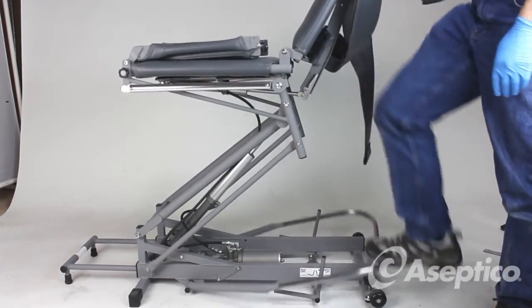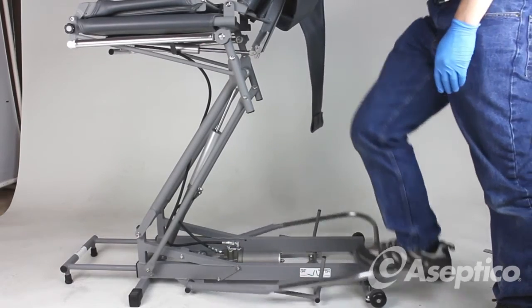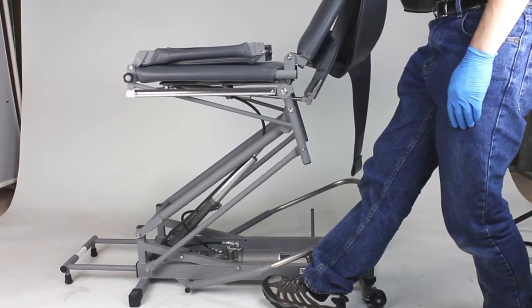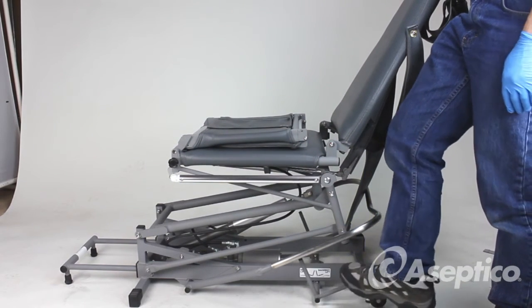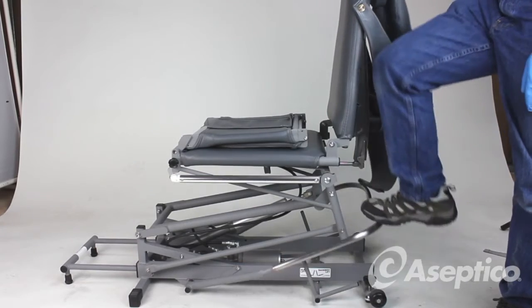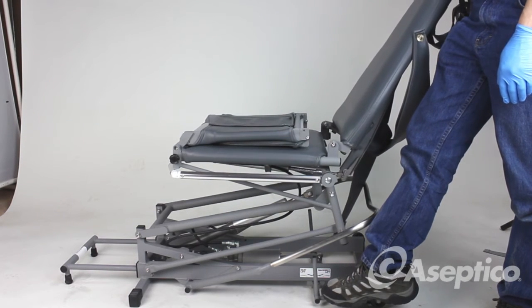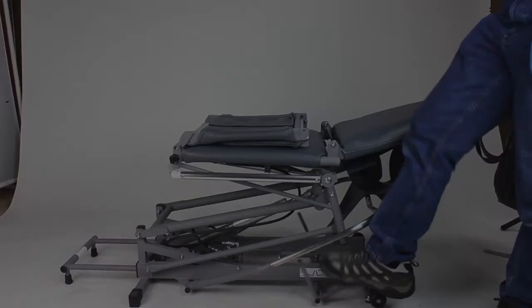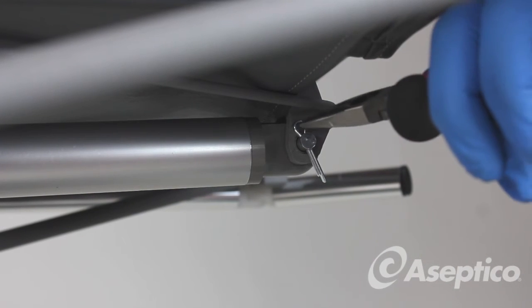Pump the chair all the way up, then release all the way down. Use the selector on the backrest, pump all the way up, then release all the way down. Lock down the cotter pins.